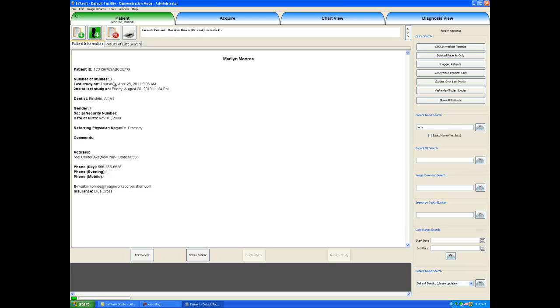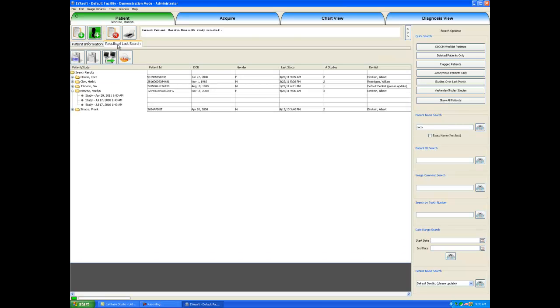I will come back to the results of last search tab, and this will show us again all of our patients in the database.